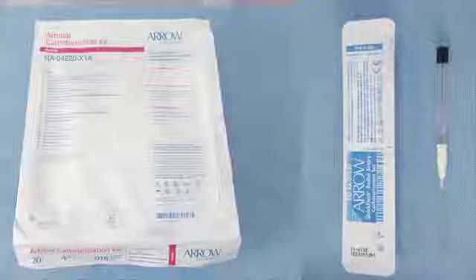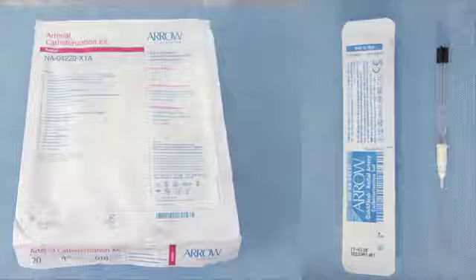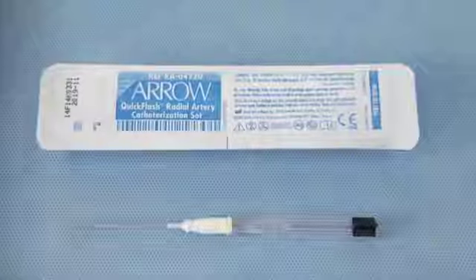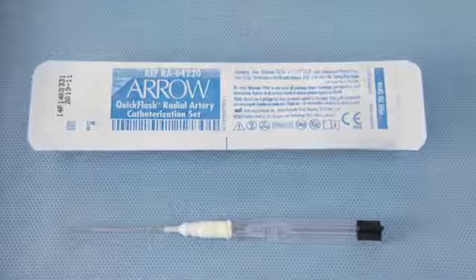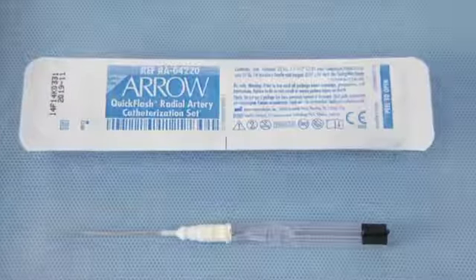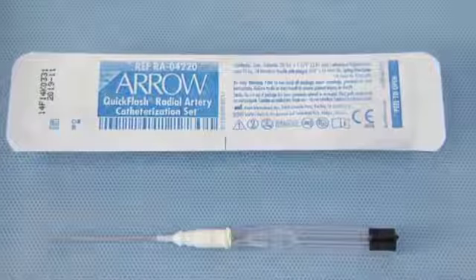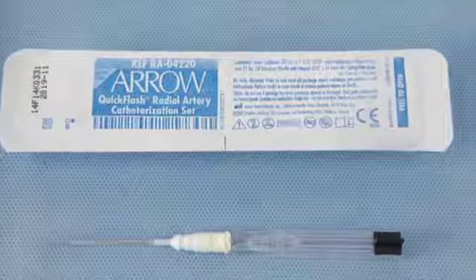This video demonstrates the insertion of the Radial Arterial QuickFlash system using the integrated Seldinger technique with ultrasound guidance. Combining the ease of use of a peripheral IV with the increased success rate of Seldinger insertion, the QuickFlash system is designed to allow for rapid identification of blood return, reduced vessel trauma, and shorter procedure times. Fast, safe, easy. The QuickFlash system.